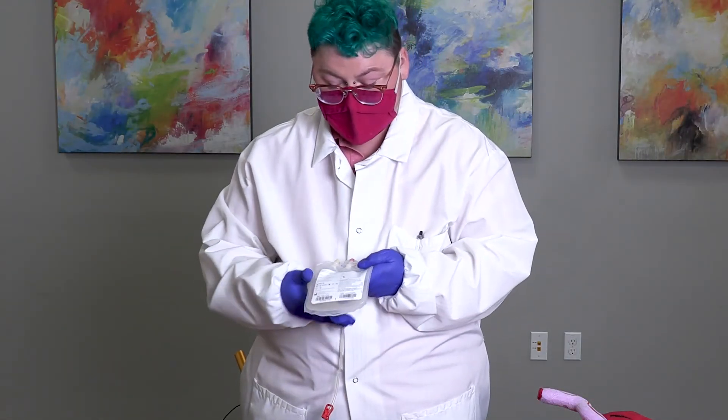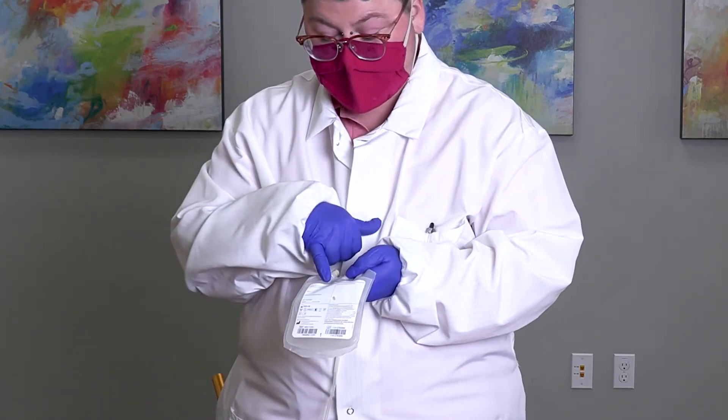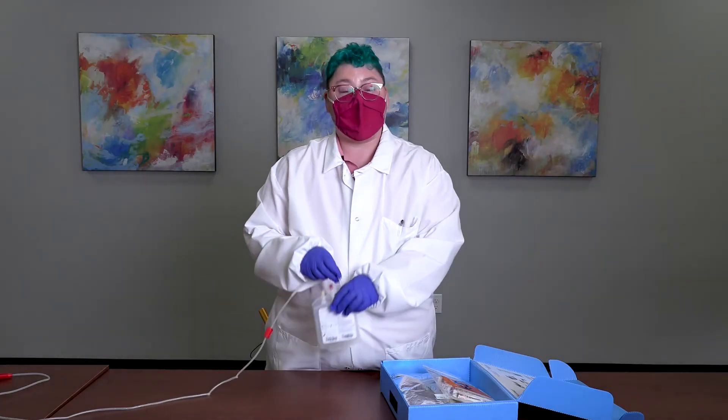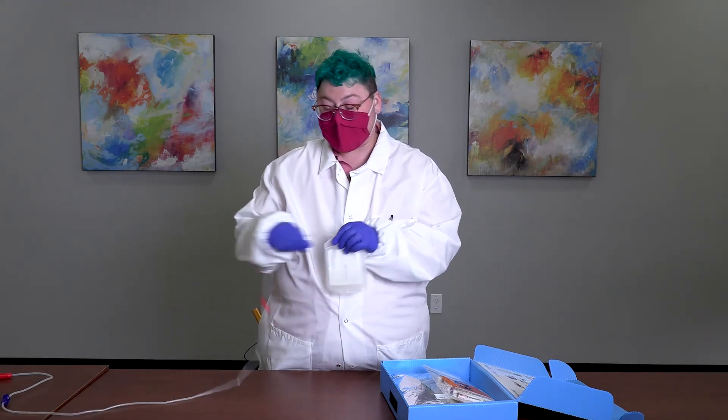At this point, label the bag. This collection bag has been designed specifically for cord blood collections and indicates on the bag 'Cord Blood Collection Bag.' This bag does not require a base label — your patient label can be applied directly to the collection bag. The C-section collection is now complete and the bag has been properly labeled. It is ready for packaging.